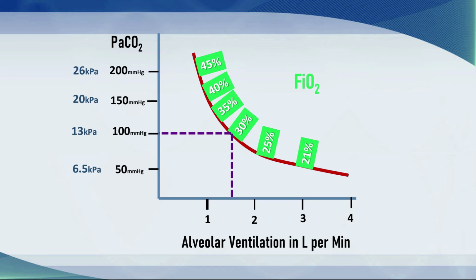Obviously, even higher levels of oxygen will cover up profound hypoventilation even more. So this is potentially a really dangerous situation where a patient could literally fall off a cliff. And I believe one of the dangers of only using pulse oximetry to monitor profoundly sedated, oxygen-dependent patients. So I think Magella in the recovery room should have nasal cannulae with that little end tidal CO2 monitor to monitor her ventilation while she's receiving that amount of oxygen, or an equivalent face mask with the CO2 device attached.